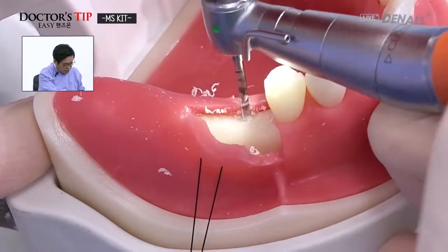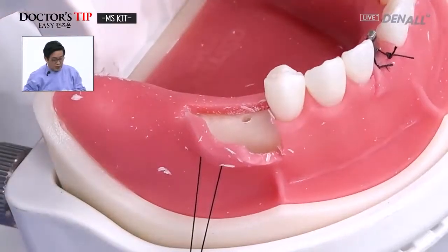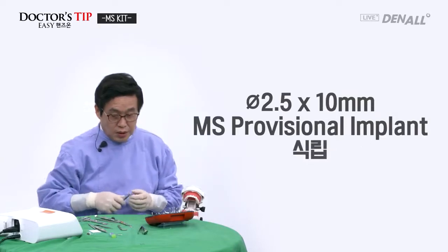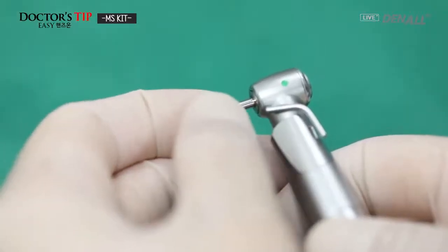I'm positioning intentionally this way to show you bending. And the provisional MS implant, 2.5 by 10 millimeters, no mount driver, short type. And again, change the mode placement.